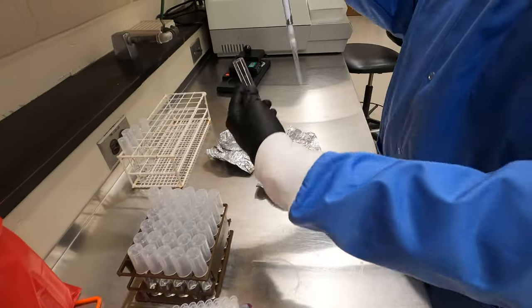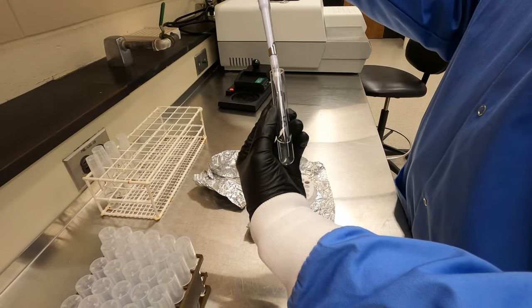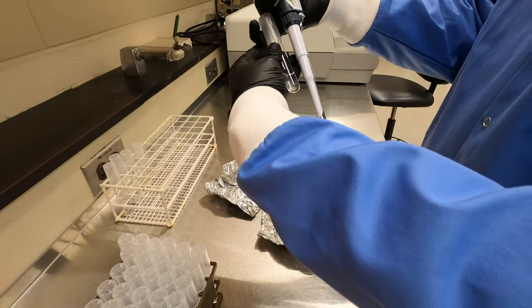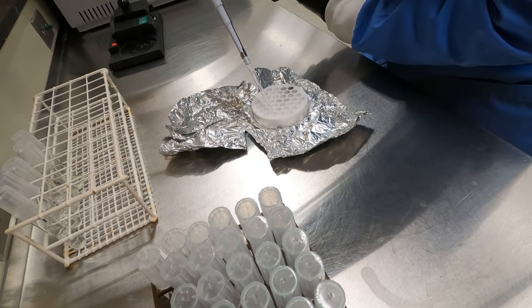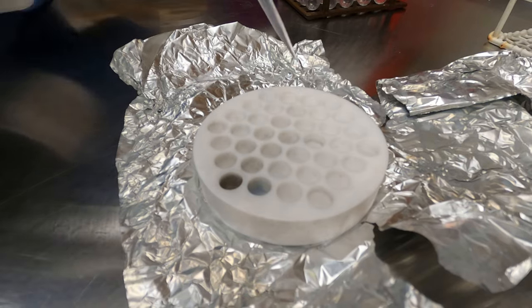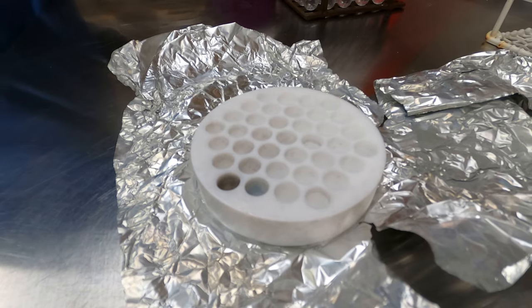To perform the test, we spot a particular volume of our McFarlane 0.5 suspension onto the agar plates. In our lab, we do this using a replicator plate system, and the first step of this process is to dispense our bacterial suspensions into each of the wells of this well plate.